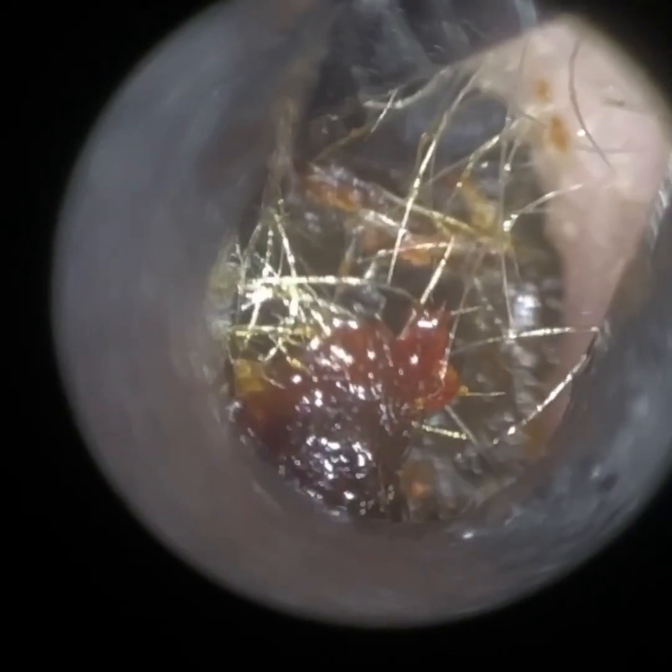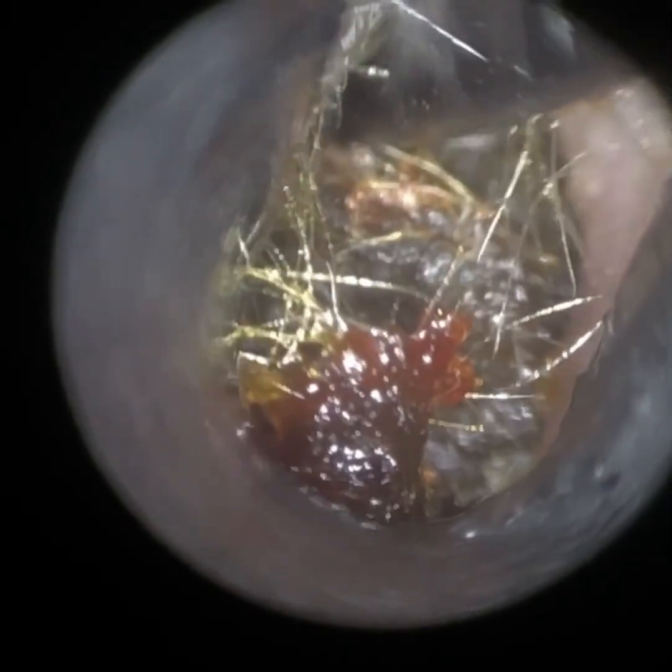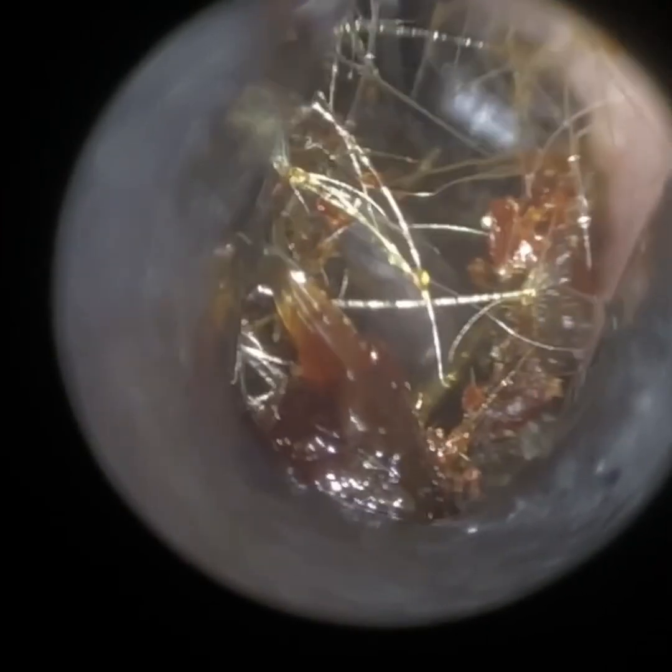So I've decided to use the ear hook here — I've just inserted it into the speculum and rotated it. With the ear hook, it's very little space to play with because of the very narrow width of the ear canal. There are quite a few hairs as well, matted. And that's one of the telltale signs — when people use cotton buds and they impact wax further in the ear, they also impact the dead hair and loose hairs within the ear canal.